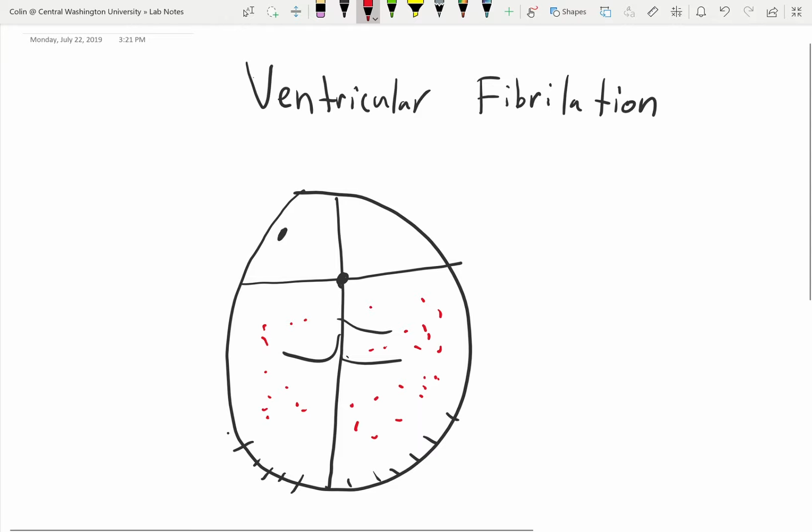So a typical patient we're going to see with this is your 70-year-old male patient. You're going to get dispatched to unconscious, unresponsive, or maybe CPR in progress. You're going to get there and do all your basic stuff. So you get there, you look, listen, feel, right? So we go unconscious, so we go for a carotid pulse. They've got no pulse, they're not breathing. Okay, so we're going to start CPR. You're going to tell one person to start bagging, and then you're going to have the other person hook up your AED, and away you go.